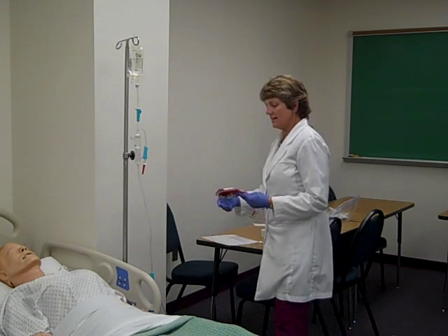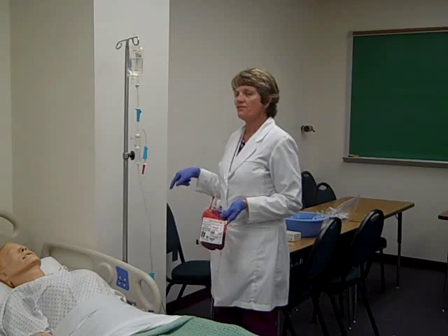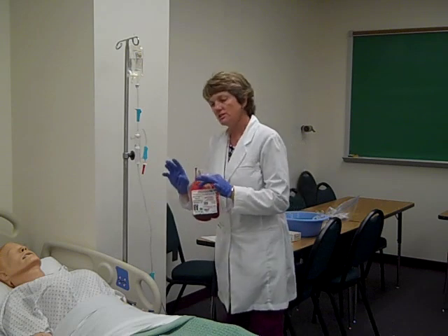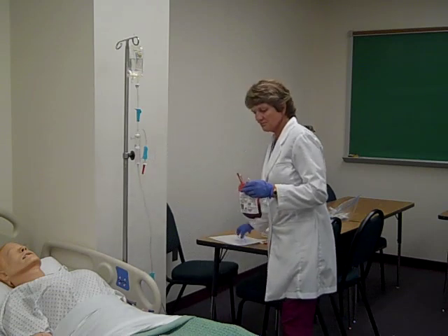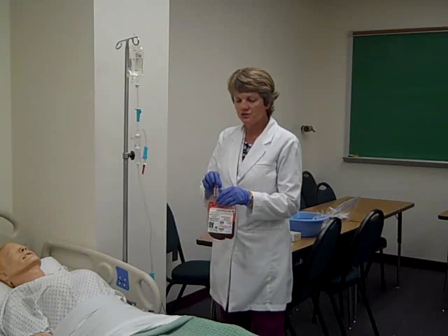Okay, and at this point also, I'm going to take the patient's vital signs just before I start this transfusion, just to make sure. Now the vital signs were fine before I went to get the blood, but it's essential that you put the pre-transfusion vital signs on this requisition form. So I've taken vital signs, they're fine, temperature's fine.